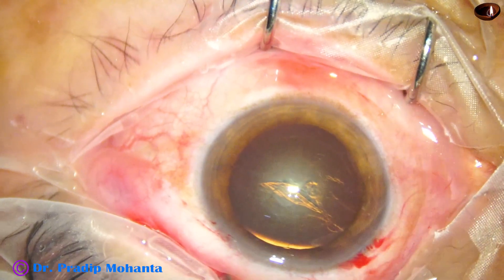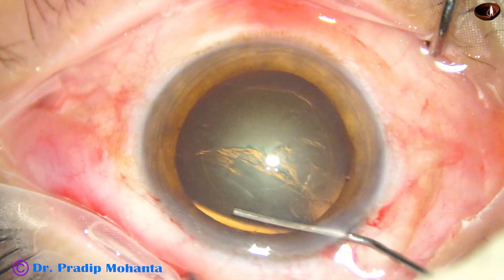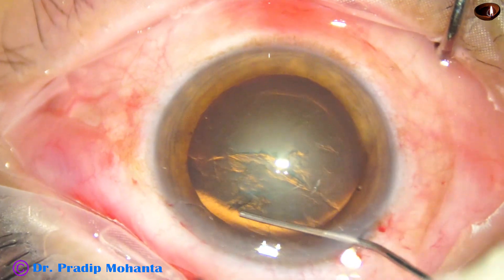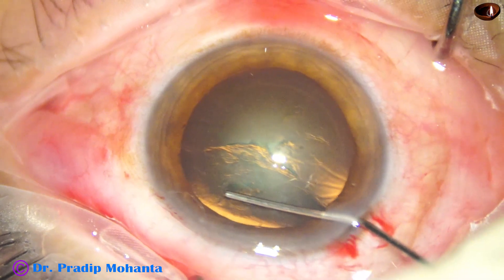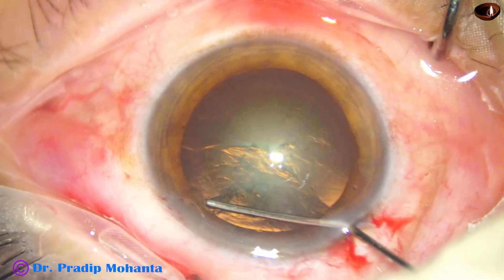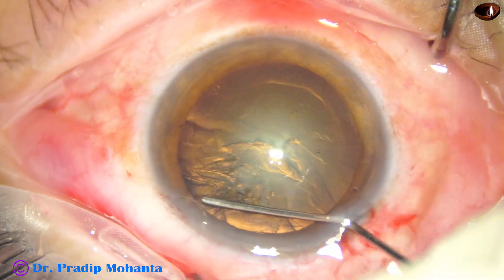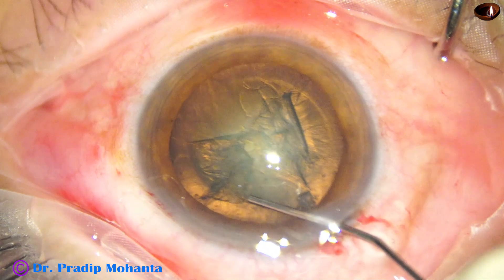For hydrodissection, the cannula is introduced and we have to just go under the capsule, create a space, go up to the equator, near the equator, and inject fluid and see the fluid wave goes from one side to the other side.